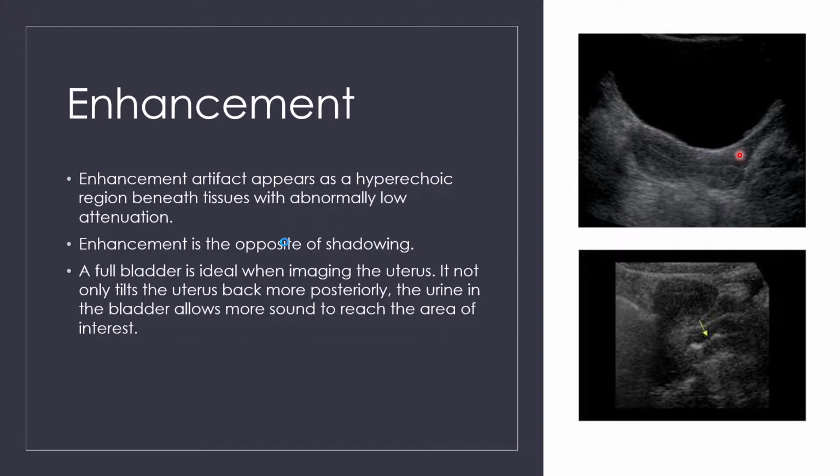So we can see here, this looks like this little golf putter. Okay, so this golf putter right here, this is the vaginal canal, this is the cervix, and then we have the uterus here. All right, and so this is the fundus of the uterus, this is the body of the uterus, the lower uterine segment, and then the cervix. We can even see the cervical os here, and I'm going to follow it into the endometrium with this red pointer. So here, going through the cervix, now we're in the endometrium, so right in here.